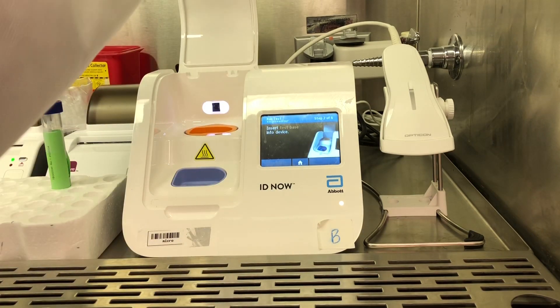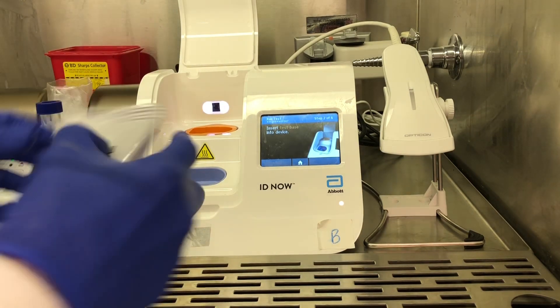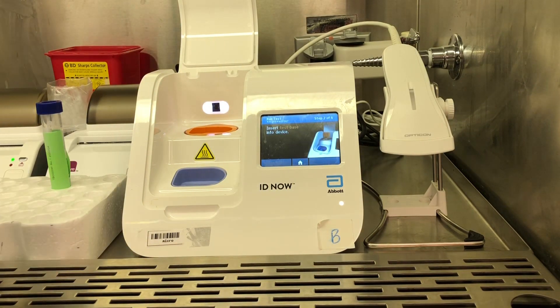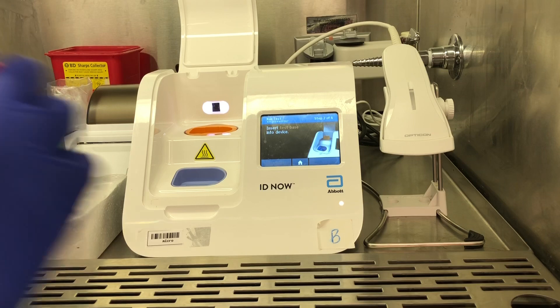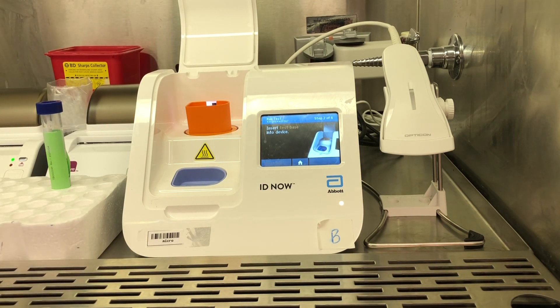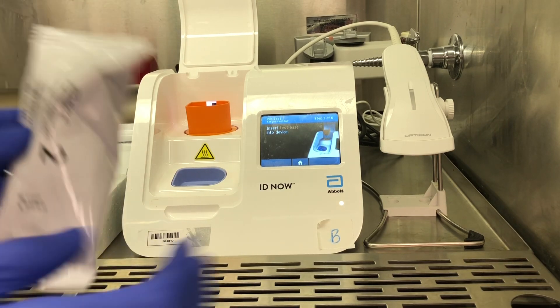It'll ask you to open the lid. From here, you'll open package number 1 and insert the test base. It can only fit in one direction because there's a QR code that faces the light and a sensor — a little camera — that'll read the QR code and identify that it is a COVID-19 test that you're trying to run.